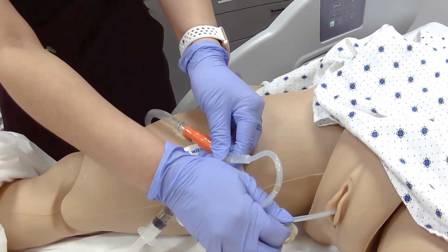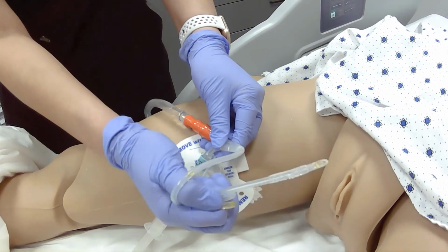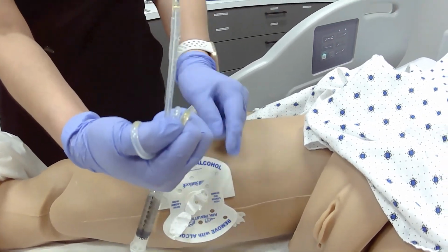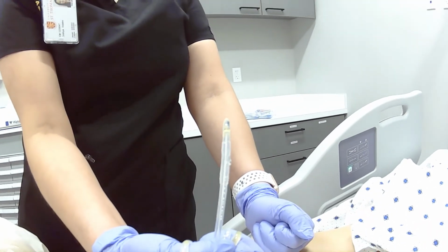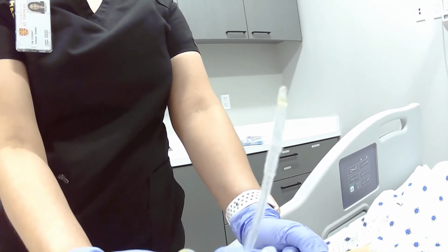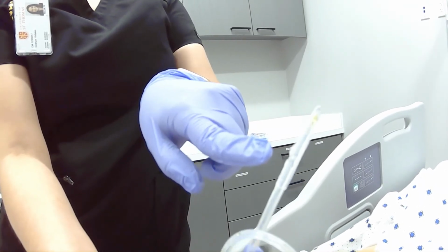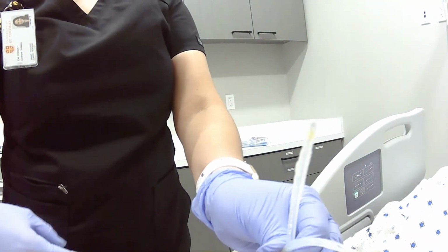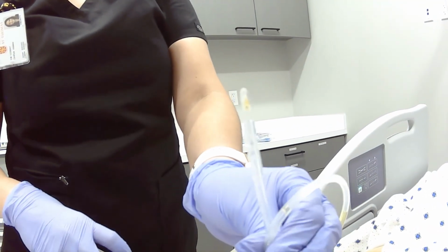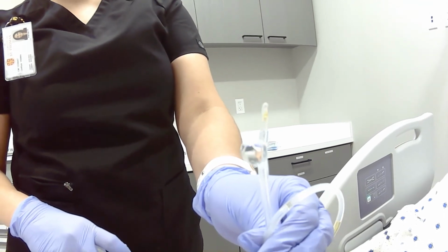And you're asking your patient if they have any problems, any pain, discomfort, and as it's coming out, you want to assess, does it look intact, or does it look like maybe the catheter tip has broken off, or the area around the catheter balloon has burst. So I'm going to show you real quick what the balloon looks like when it's inflated.